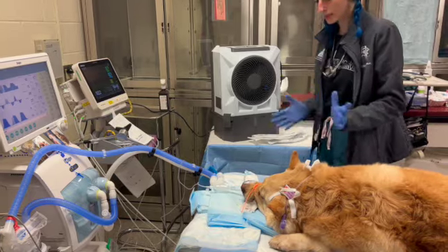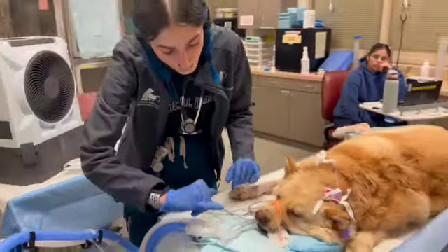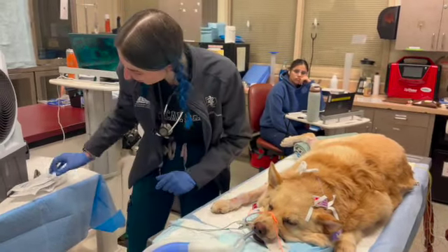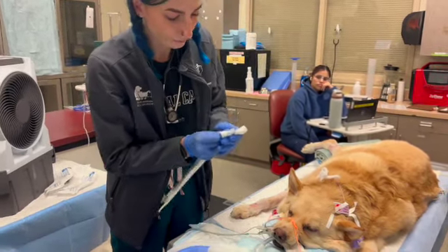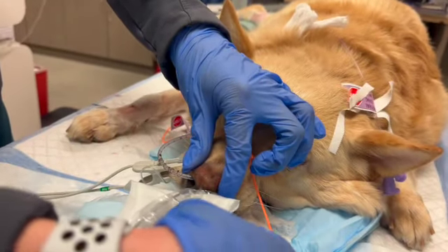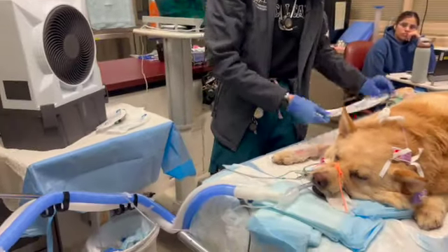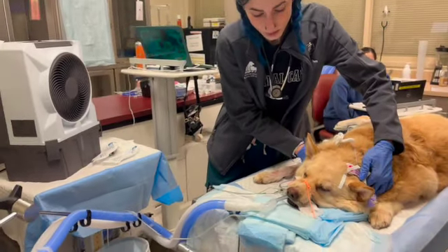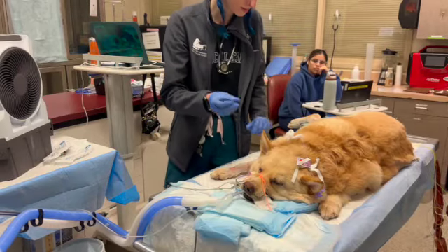In determining the size for endotracheal tubes, there's a few ways that you can determine it. You can actually go by measuring in between his nares, and that's a good indicator of his tube size. His current tube size is a 7.5, so you can take the end of your endotracheal tube and place it in between, and if it fits, typically it'll be a good indicator that it would fit your patient's trachea. Another good way is by measuring the trachea itself, so you can just palpate the patient's trachea and go based on your palpation size.